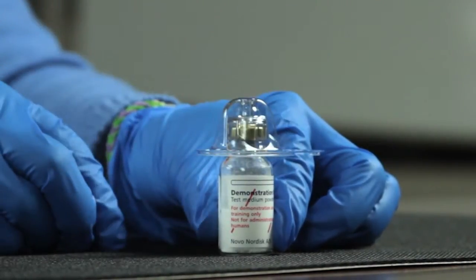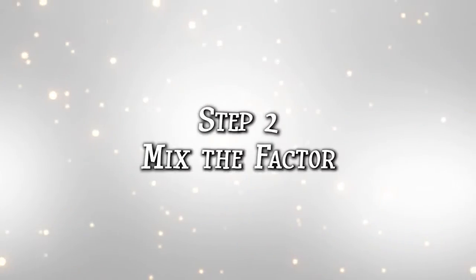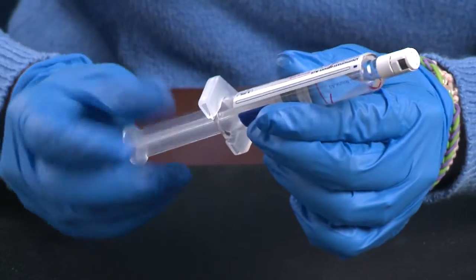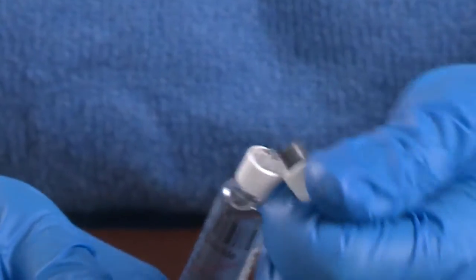Turn the protective cap over to cover the vial. Snap the vial adapter onto the vial. Lightly squeeze the protective cap to remove it from the vial adapter, but do not touch the vial adapter. Screw the plunger into the fluid-filled syringe. Remove the syringe cap, but do not touch the syringe tip.